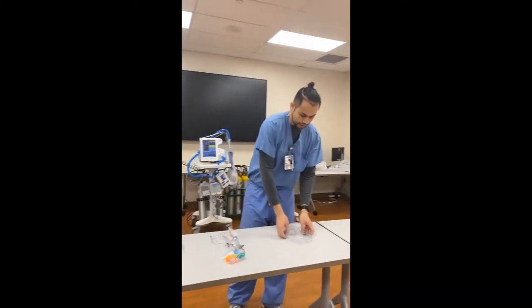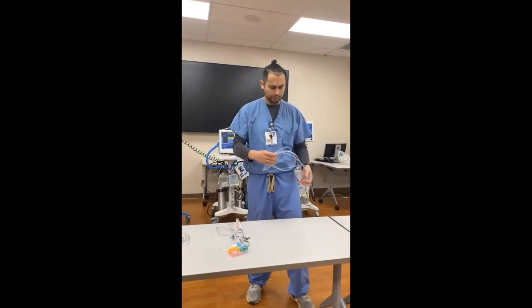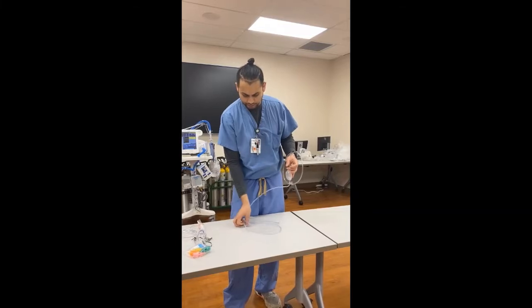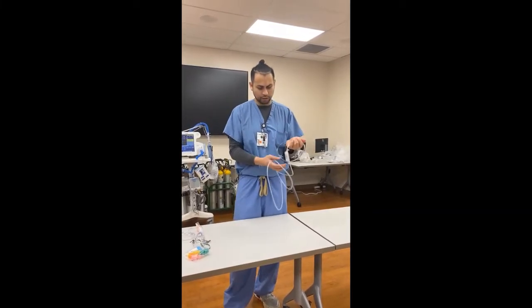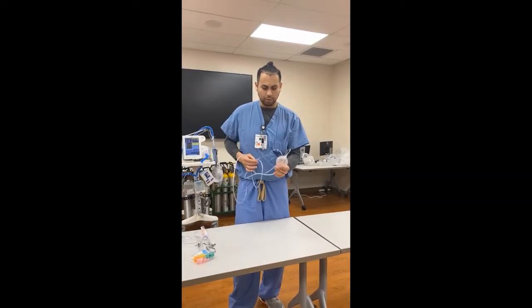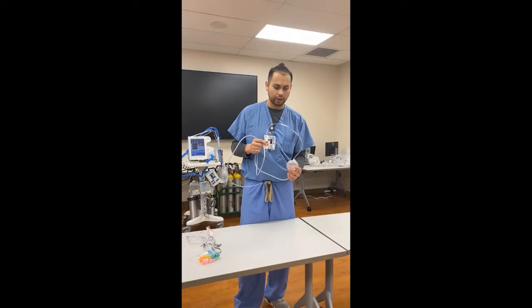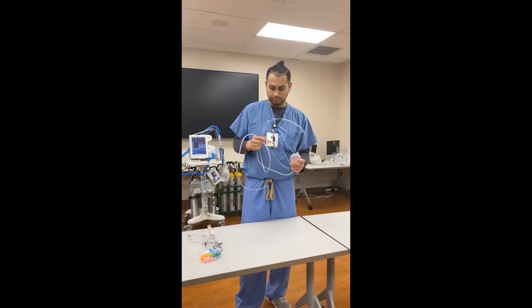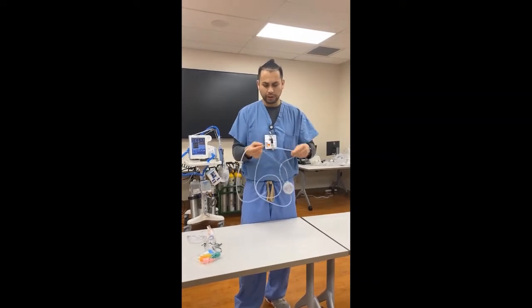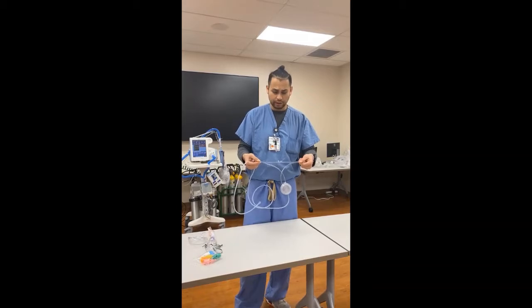Then we have the Oximizer. It's one of our devices that we use. It's a nasal entrainment device also. This little pendant right here will help entrain oxygen. Every time the patient breathes in, they get a good dose of oxygen concentration. Picture a non-rebreather that is nicely compressed in this little plastic circle here. The tubing is much thicker to provide more flow to help with any tachypnic issues.